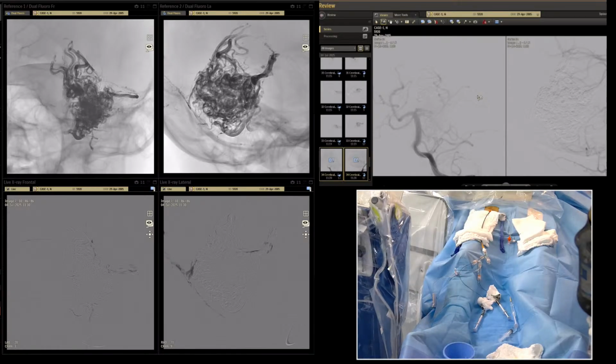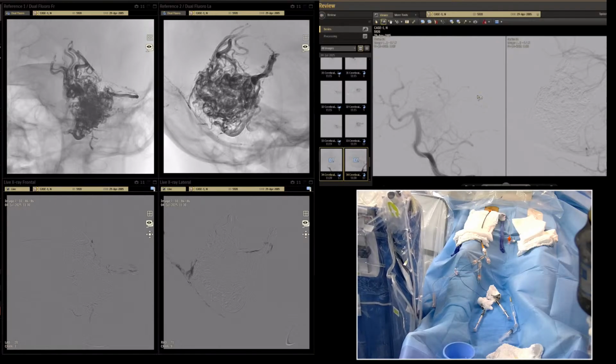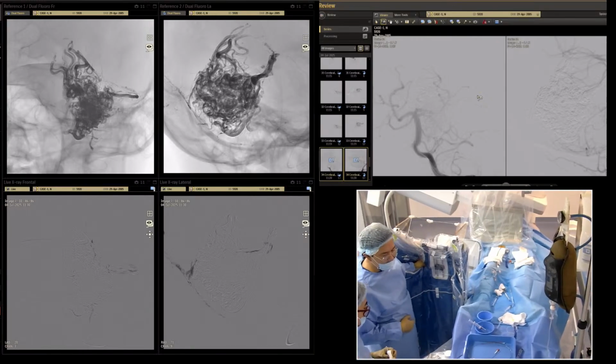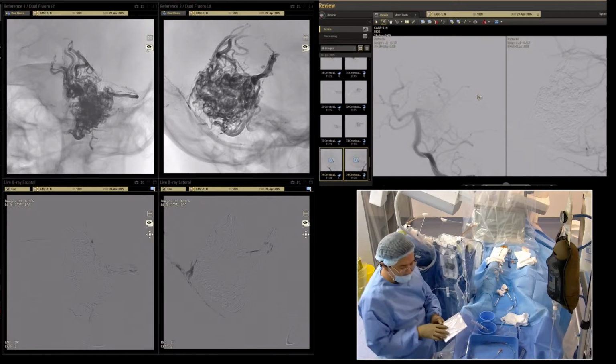At the end we will check the ICA on the right vertebral before the finish, and it's a long day, and I hope if this territory will be safe, we can call this patient in a couple of months for the next session. Let's call it next session, it's not the last session, but I hope it will be the last session.